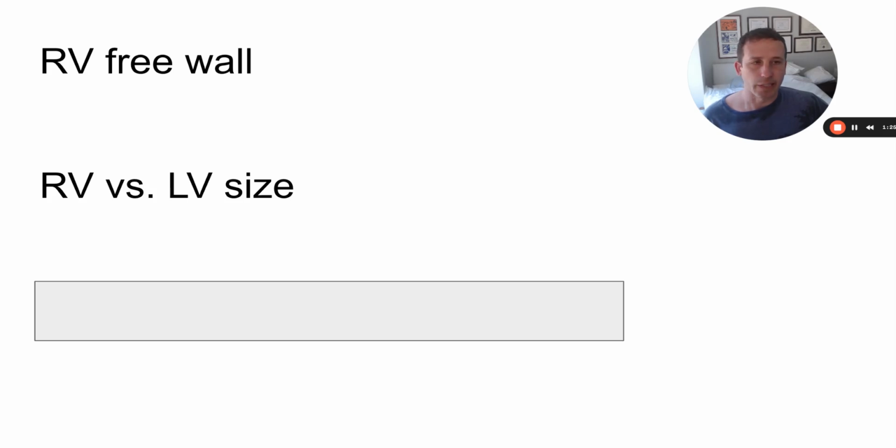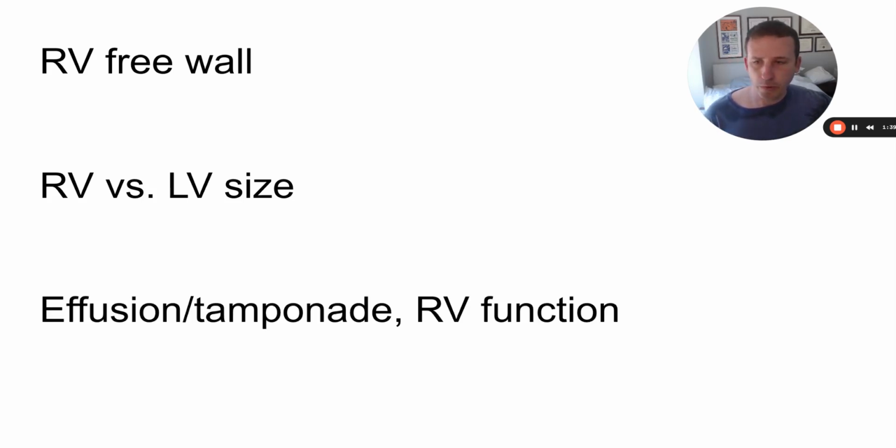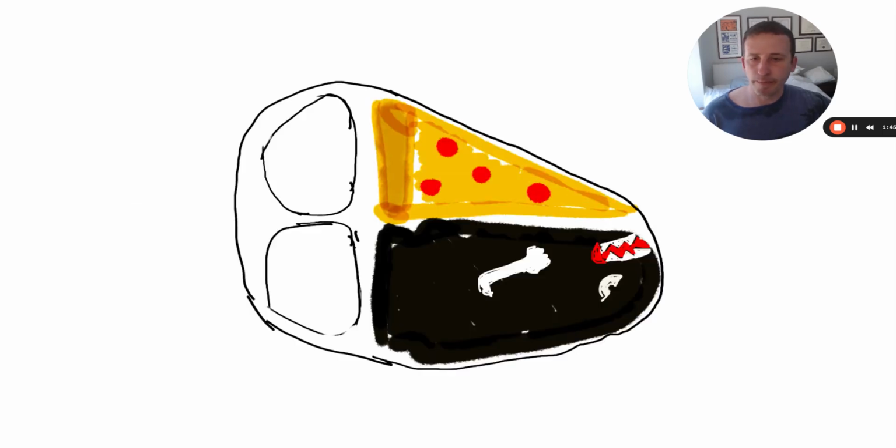RV versus LV size. So comparing the two chambers side by side, the RV should be about 2/3 the size of the LV. If it's equal in size to the LV or bigger, that could be indicative of right ventricular enlargement. And we're looking for effusion or tamponade and assessing right ventricular function subjectively.